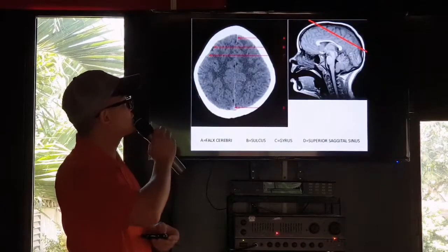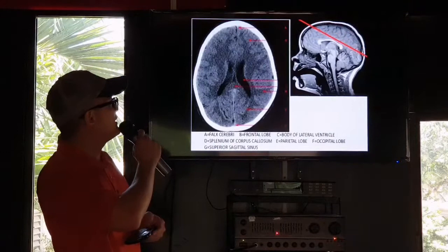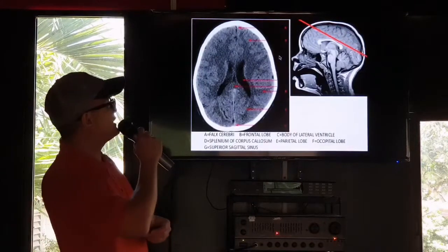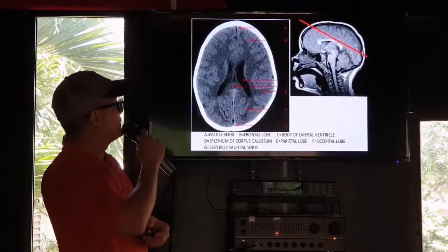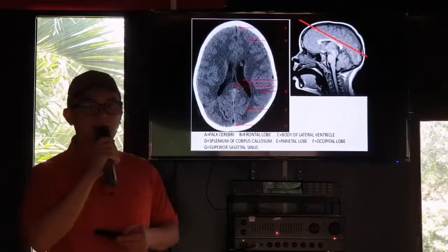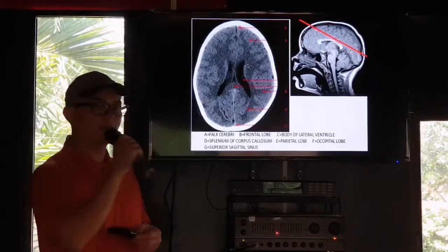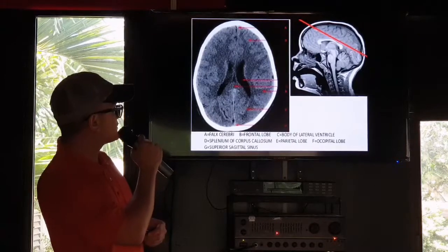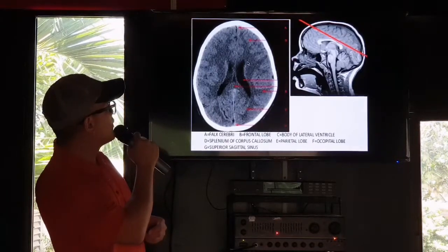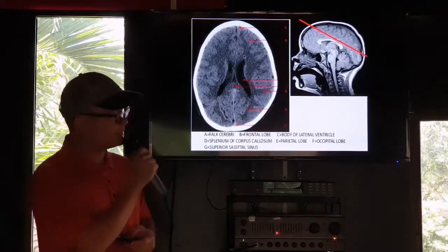The views shown right here are mostly soft tissue window. If you can see, the bone is not clearly defined, right? It's very white, it's not clearly defined. Whereas in the soft tissue, the brain, you can see some detail. You can clearly see some structures are more white and some structures are more gray or darker.